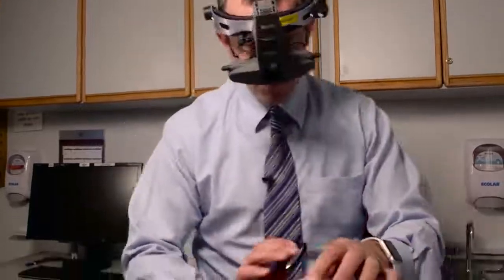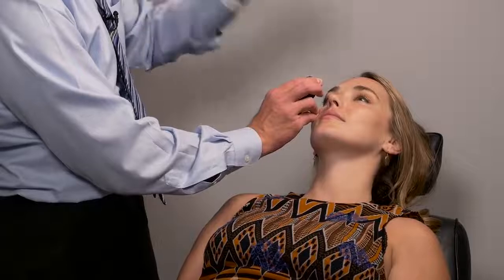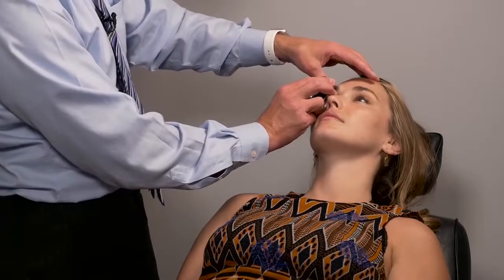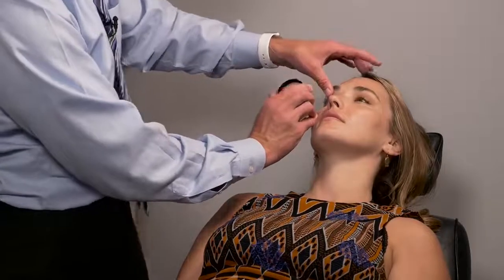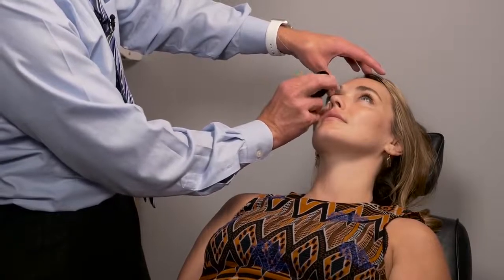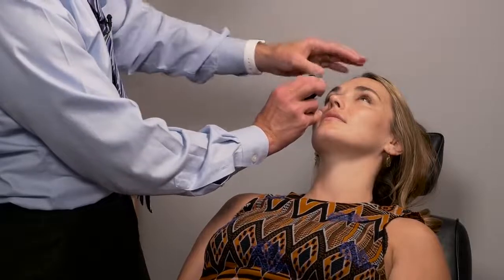So first thing I do, again, pinky on the cheek. I already know where my head position is. I look at the cornea, the iris. I see my orange reflex of the posterior segment. I pull backwards until the retina is in view. Then I tell the patient to look up. Same thing: I'm moving the lens forward and back. My head generally stays still because I know where that proper position is.